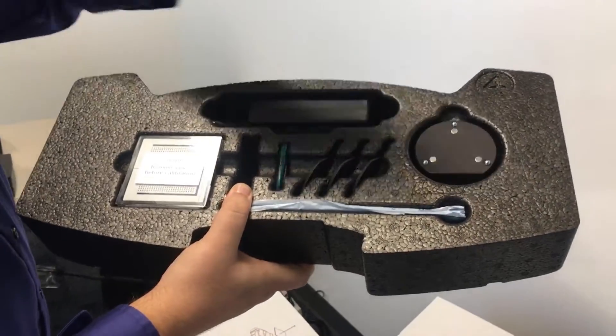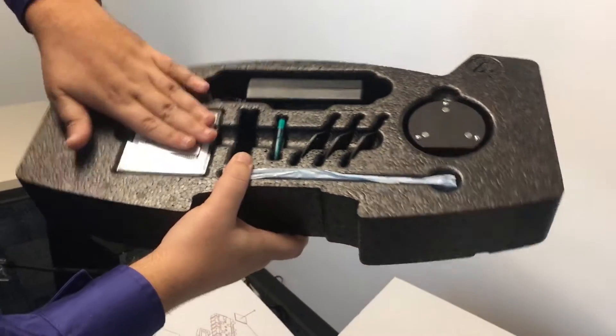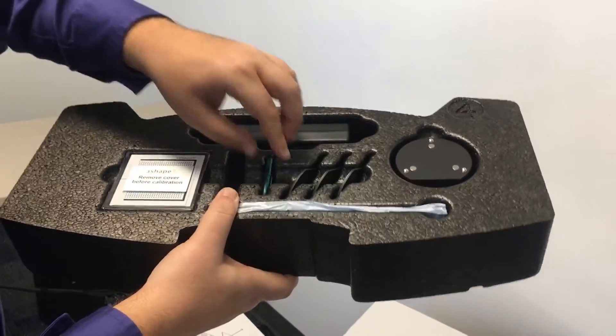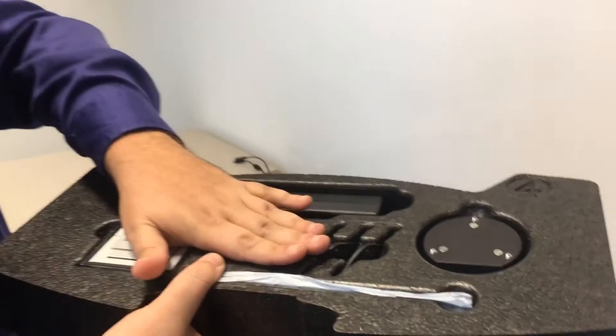Here's everything you need that would normally be in a 3Shape calibration kit. You have a spacer platform, your scanning plates, the power supply with cables, your calibration plate, your BluTac, and most importantly, you have your dongle. It's important to remember this needs to be plugged in for everything on your system to work. We'll go over that in a little bit more detail later.